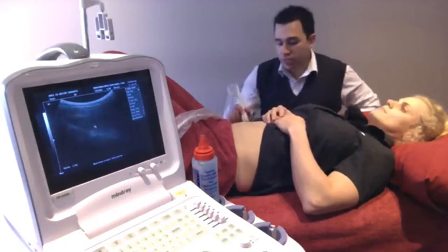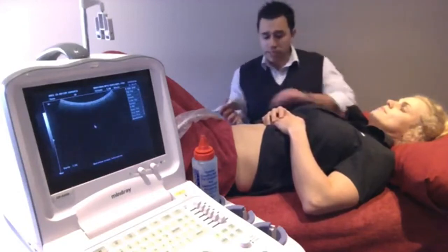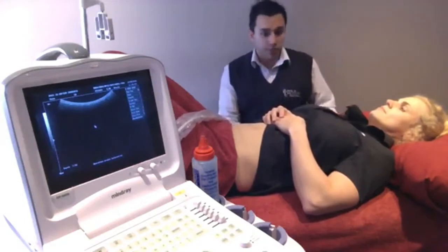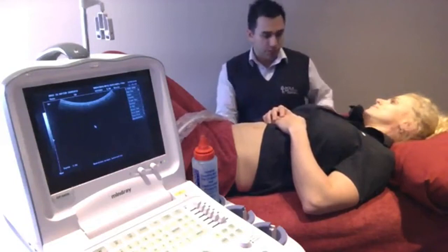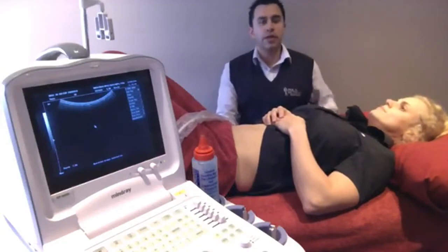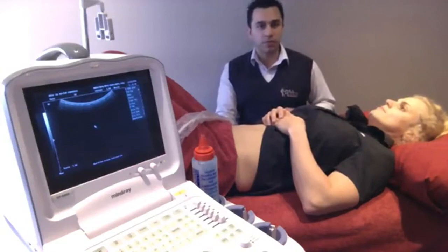So now what you can do, now that we're confident that we've got the activation correct, we can start to incorporate that into functional movements. So Josie, when you go from sit to stand, before you sneeze, before you pick up a box, engage those tummy muscles. Basically what we're trying to do is trip the brain into thinking: when I move, I want this muscle to switch on.